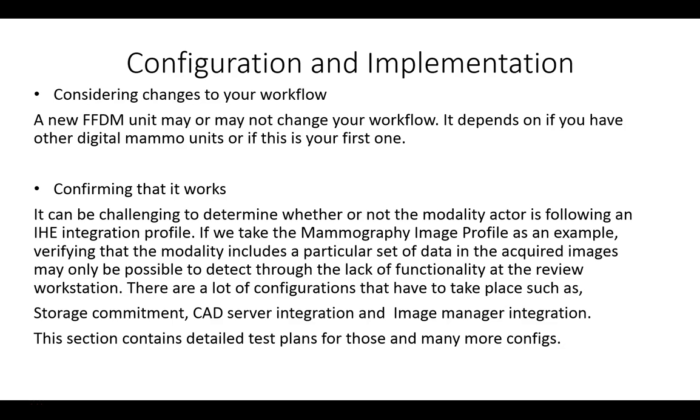Confirming that it works. It can be challenging to determine whether or not the modality actor is following an IHE integration profile. If we take the mammo image profile as an example, verifying that the modality includes a particular set of data in the acquired images may only be possible to detect through the lack of functionality at the review workstation. There are a lot of configurations that have to take place, such as storage commitment, CAD server integration, and image manager integration. This section contains detailed test plans for those and many more configurations.